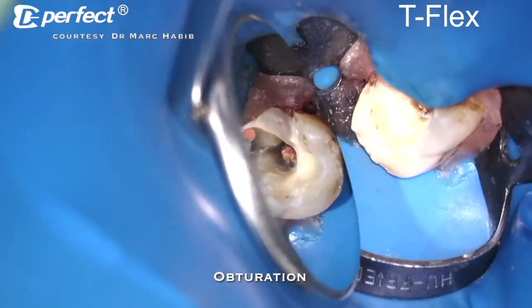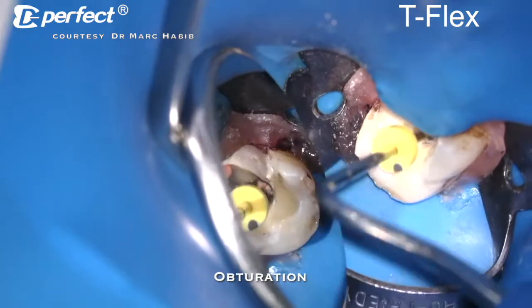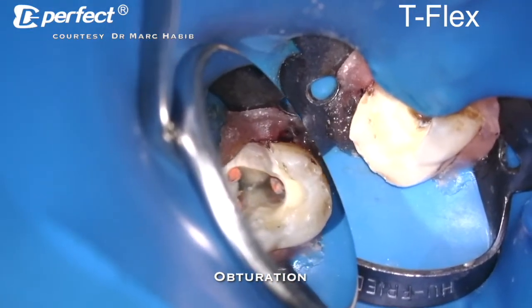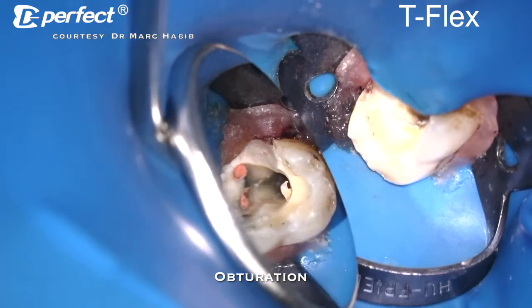This is the coronal plug, and we go ahead and we plug, heat and plug till we reach 5 millimeters from the foramen in each of the 3 canals.